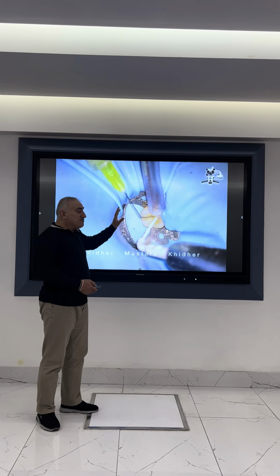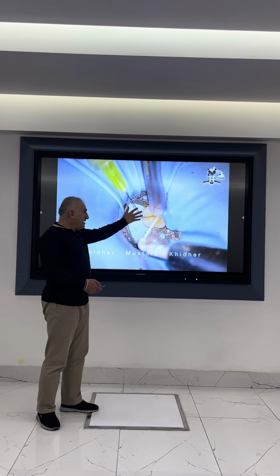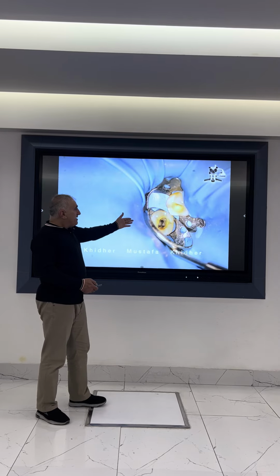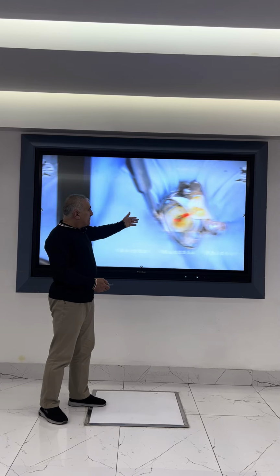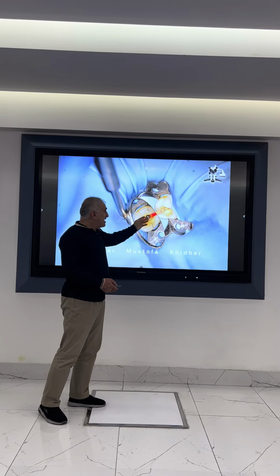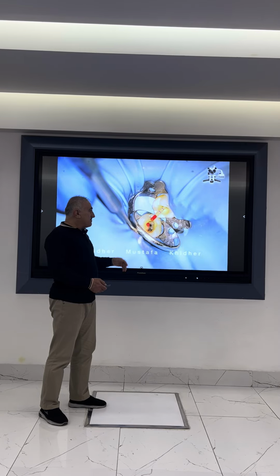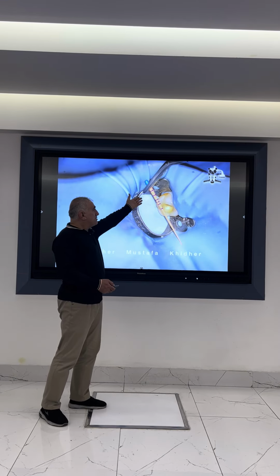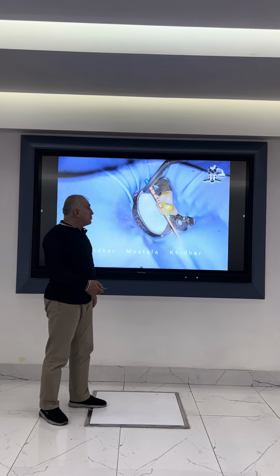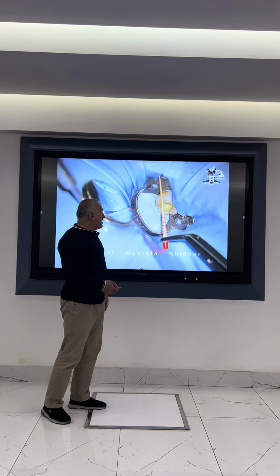Then I make the final disinfection of the canal, at least about 2 to 5 minutes according to the number of canals. Then the case is ready for obturation, and I put the sodium hypochlorite inside and do the gutta percha selection, starting with 25 taper 4 for the mesial canals. Then I see that it is a little bit over in one of the canals. Then I use the 30 to be sure that the canal is exactly at the full working length, with a positive tug back. Then 25 taper 6 for the distal canal.